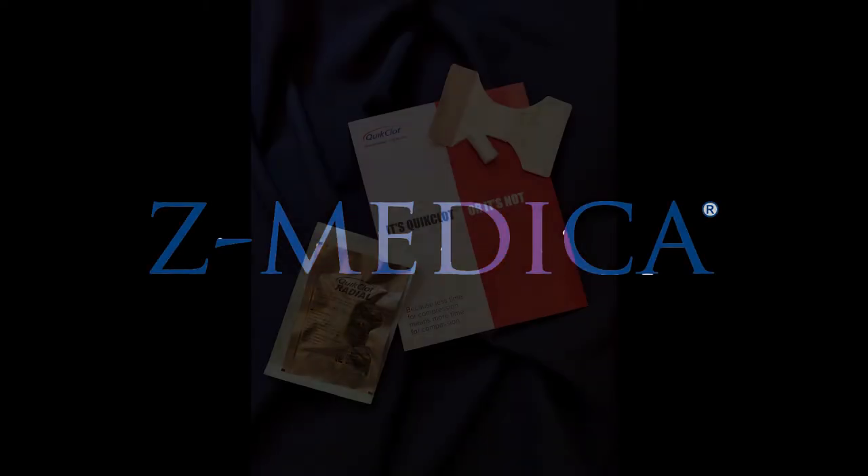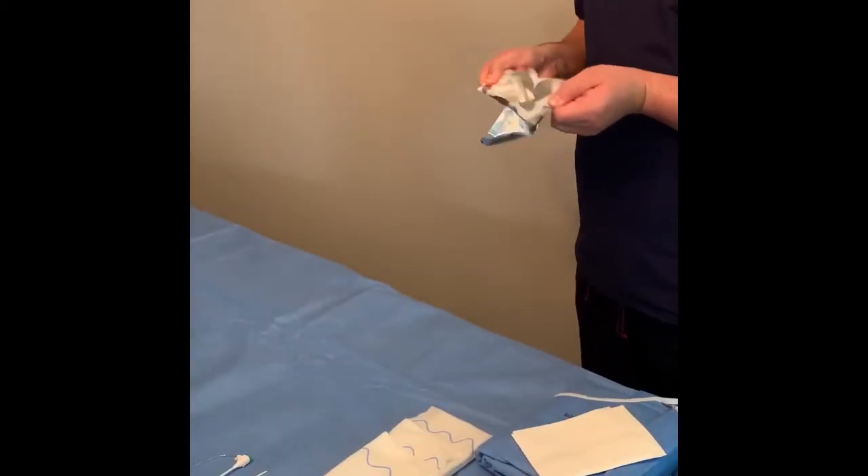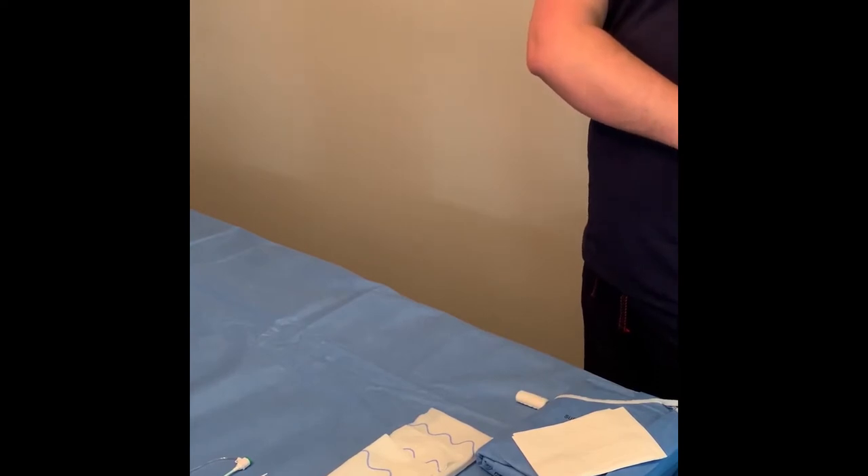The following outlines the proper steps in applying the Quick Clot Radial device. Open the package onto the sterile field in a dry area.